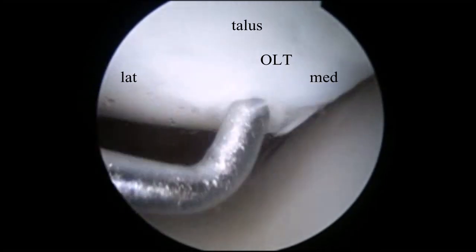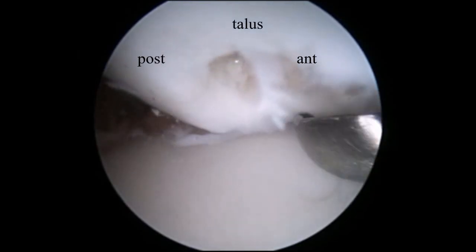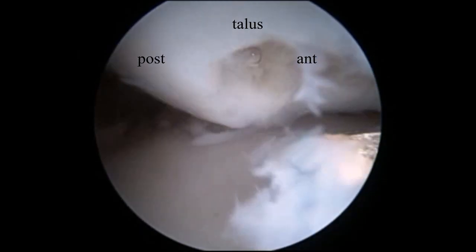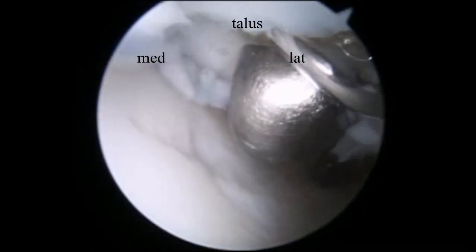This is a view from the anteromedial portal and you can find the osteochondral lesion on the medial talus. This is a view from the anterolateral portal and it is easy to trim the posterior part of the lesion with a curette from the anteromedial portal.